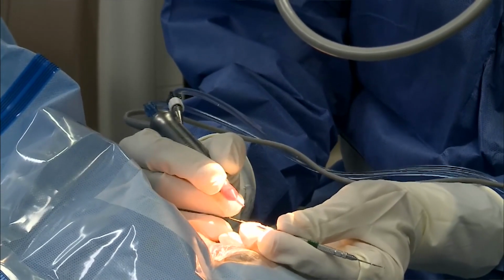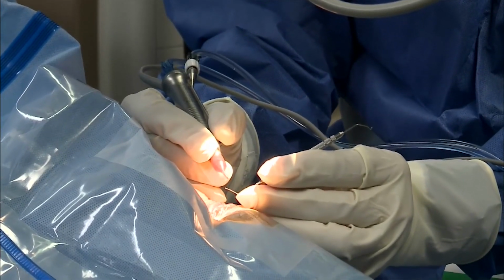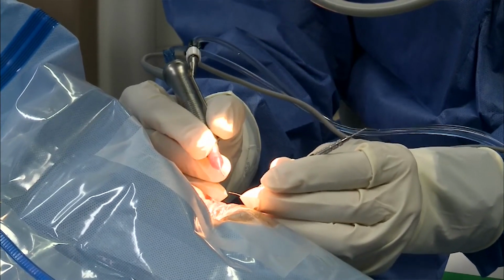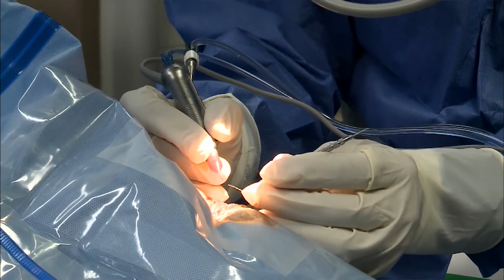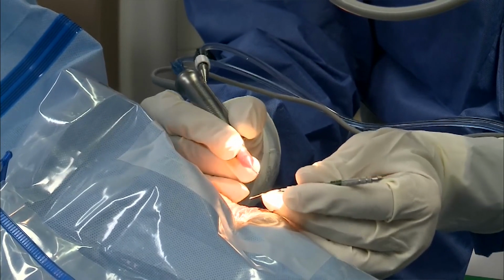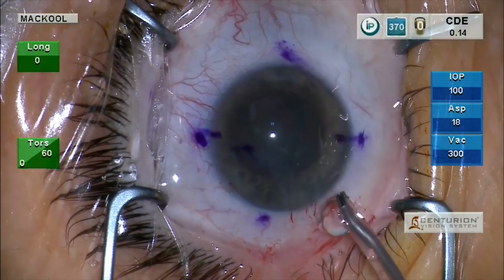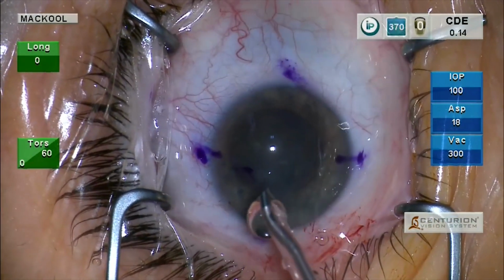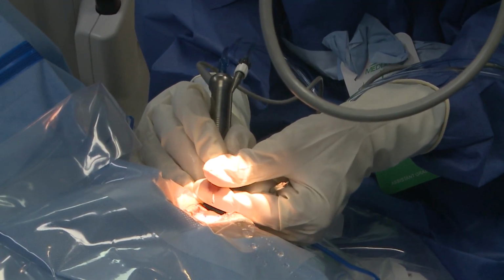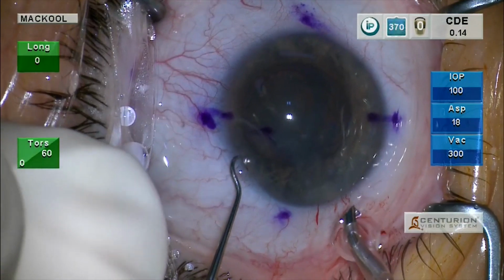Notice how the second instrument, my 3rd finger is so far down, it would almost get in the field, but it doesn't. Okay? That's a very precise instrument for chopping and moving things around. This one goes out to the periphery, but I like to have that 3rd finger way down on the handle, as you see there. And next, test infusion capacity and sleeve position. Good infusion coming out of each side. If I didn't like it, I'd rotate this sleeve and get better infusion capacity, but it's good all the way here. So now we're ready to proceed with our insertion of instruments.